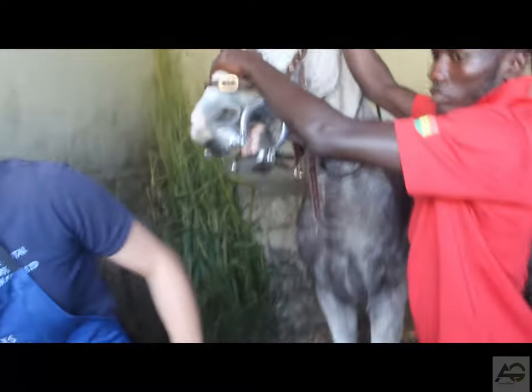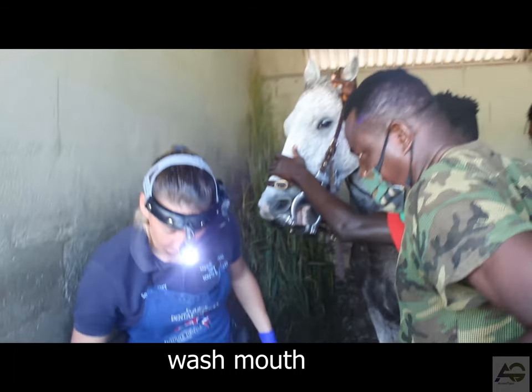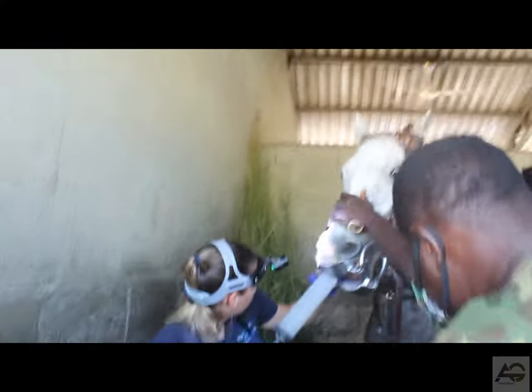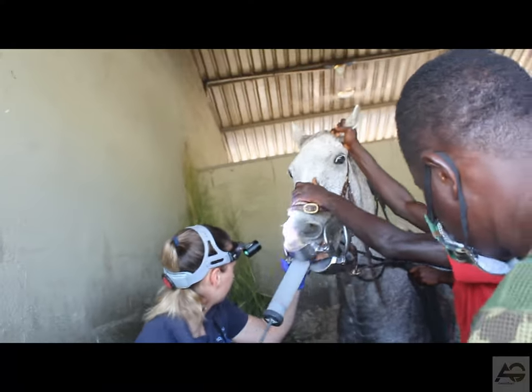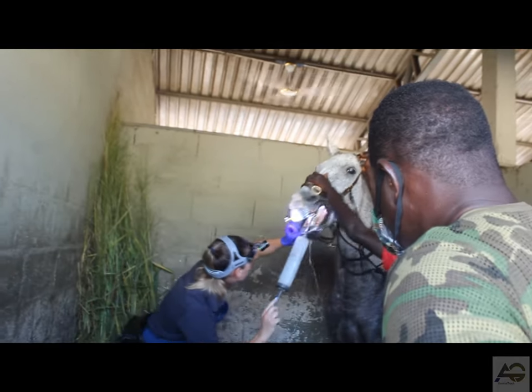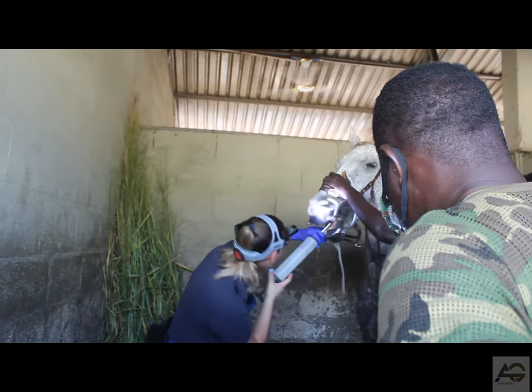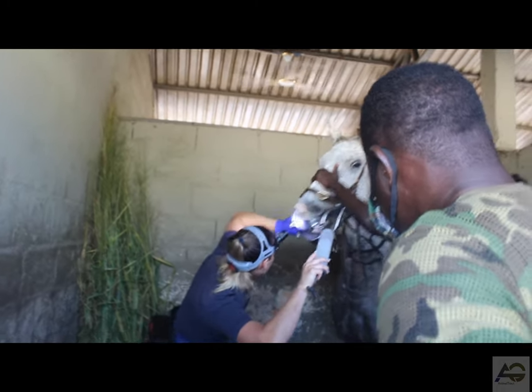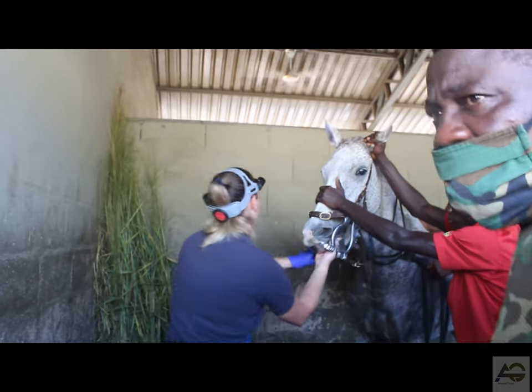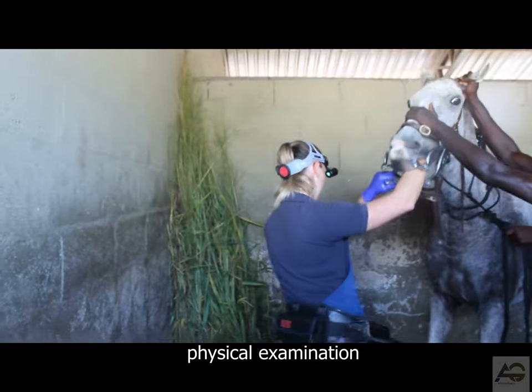Step 3: Wash the mouth of the horse with water to dislodge any food particles or dirt before the examination. Step 4: Examine the teeth in the mouth of the horse to identify sharp edges, fractured teeth, or any other condition in the mouth.